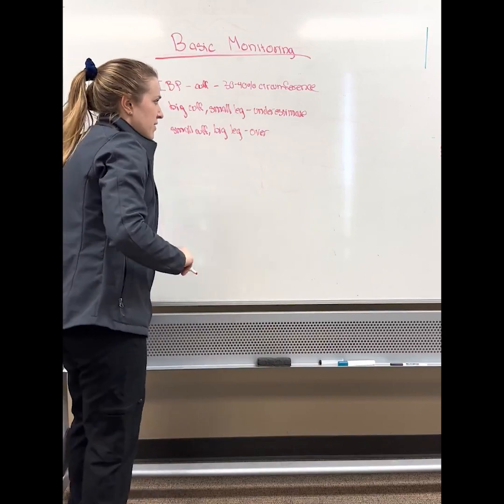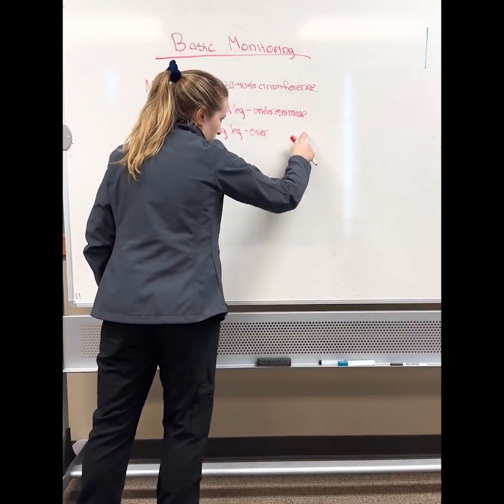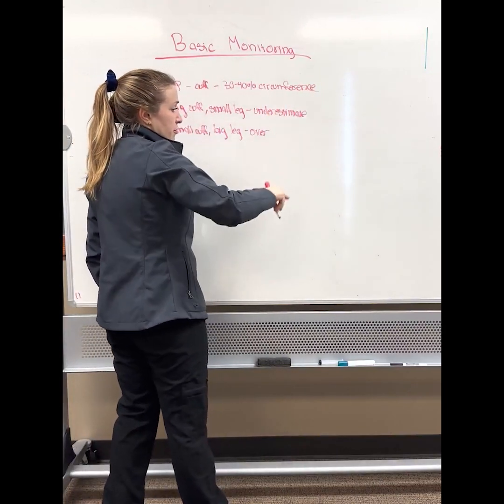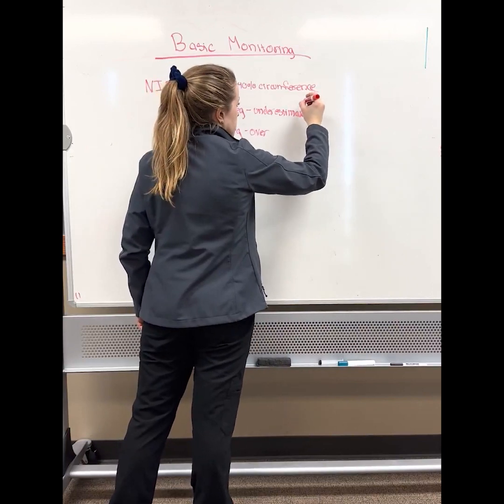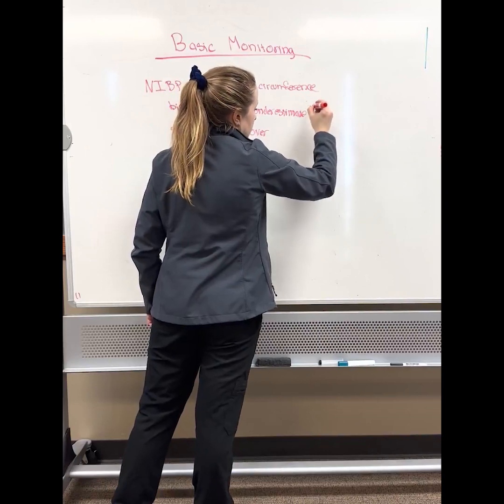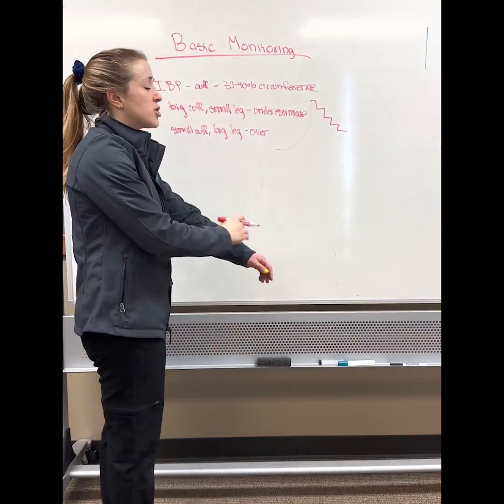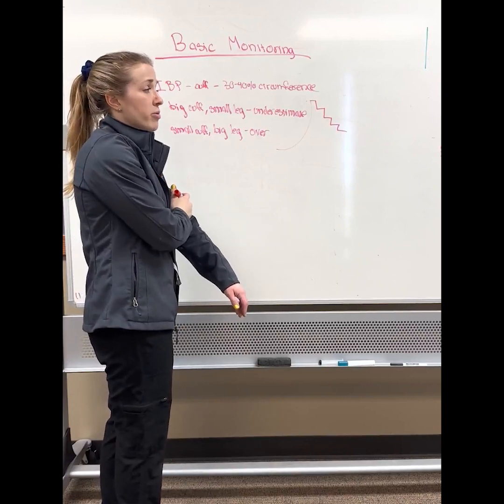So basically how non-invasive blood pressure works is that you slap the cuff on, and hopefully it's the correct size, because that's hopefully going to give you the correct, or the most accurate, reading. Basically, it is going to inflate to a pressure far above the systolic blood pressure, which is the blood pressure generated during peak heart contraction. Then it's going to start letting down pressure in a stepwise fashion. As you inflate, you're going to occlude all of the blood flow through the arteries.